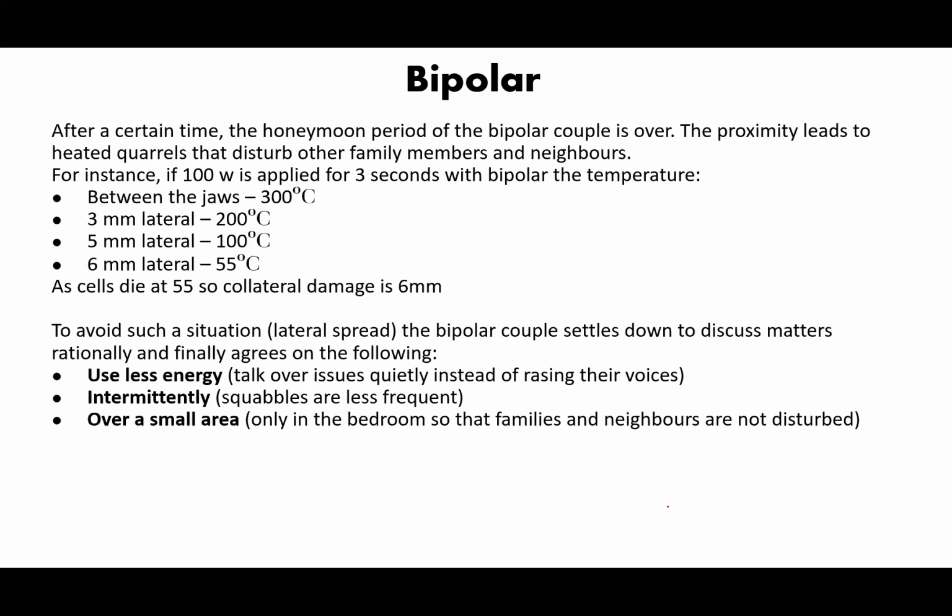And with time, as your instrument wears out, just like couples that have been together for many, many years, okay, that honeymoon period is over. The next thing, you see neighbors coming to settle quarrels and a lot of disturbances they will be causing. So that is how the bipolar is. With time, as you keep on using it, as you keep on applying it, what happens? If you apply it for a very long time, what happens? Look at what will happen.